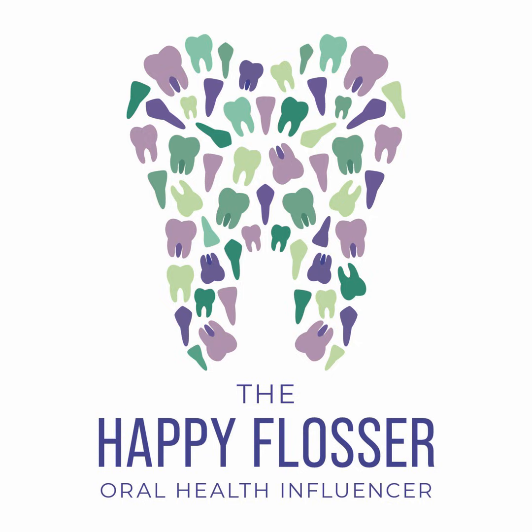For some reason, I always check for decay before I check for periodontal issues. I don't know why that is. I think it's just easier for me to look at those bite wings and look for any early signs of decay or recurrent decay around the restorations that are there. And then I move right on to looking at the supporting bone.